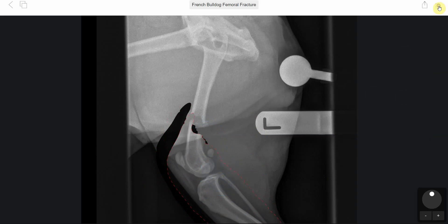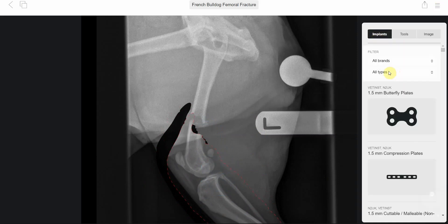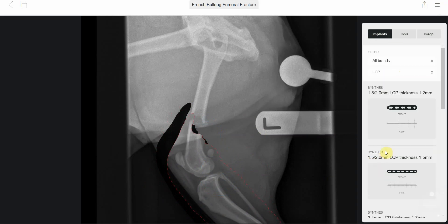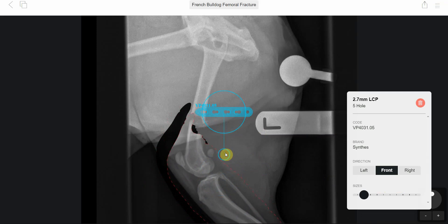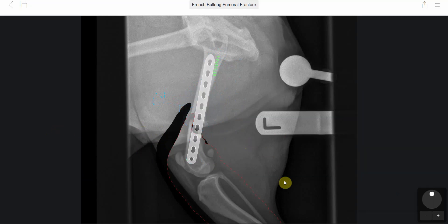Because of the fragment, we were planning to use a plate-rod construct — an LCP in combination with an intramedullary pin. The LCP was a 2.7 LCP, and we thought a 10-hole one would fit well, aiming to cover around 80 to 85 percent of the length of the femur, with scope to get a good three screws in the distal fragment. There was also the intramedullary pin in combination with this LCP plate.